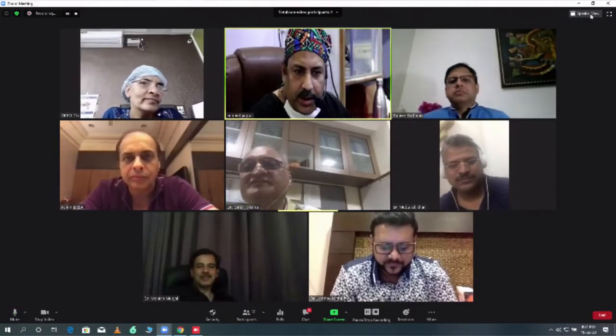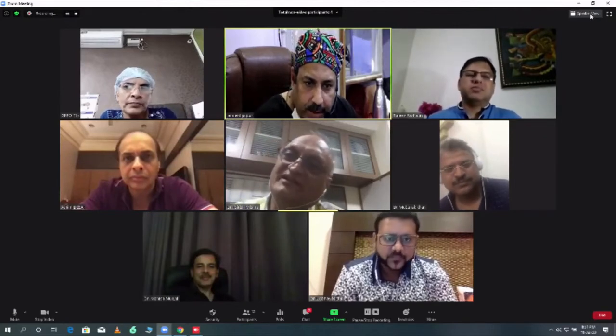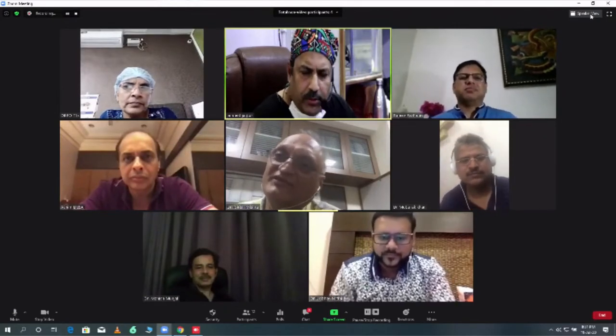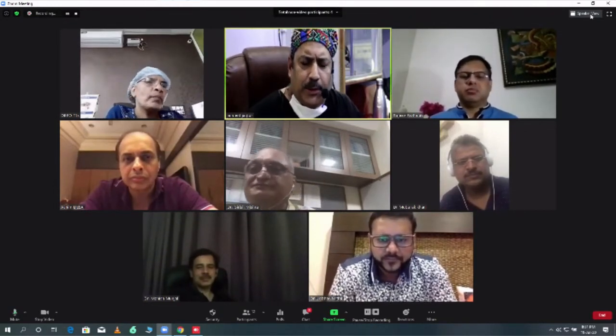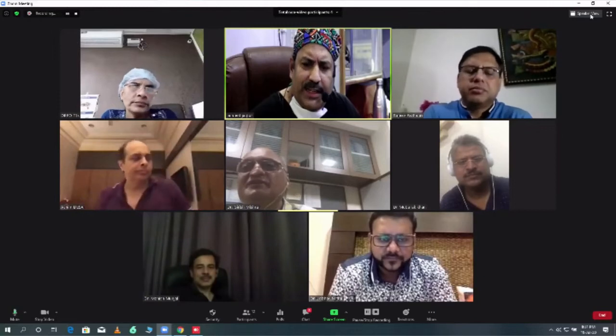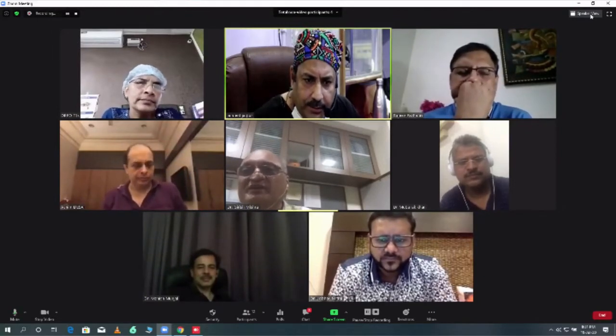Dr. Satish, this tympanomeatal flap, inferior extent should be till 6 o'clock so that you expose the round window. It need not go lesser than that. Inferiorly, you are not supposed to go too inferiorly because that is not our area of interest. In this case, the round window is also exposed completely.